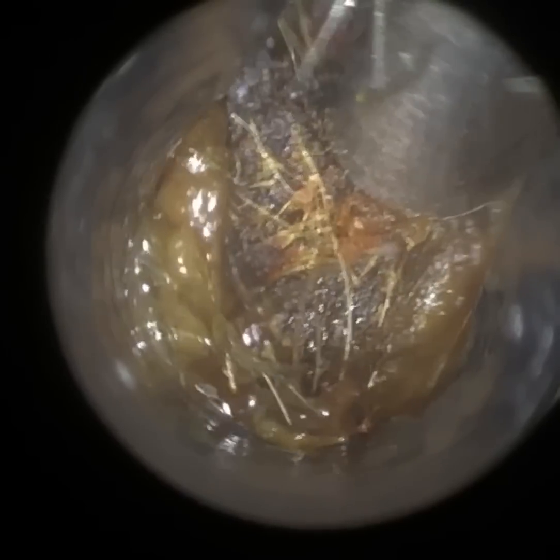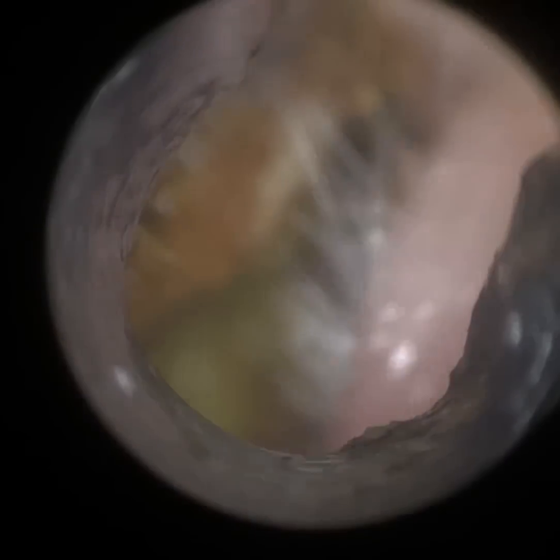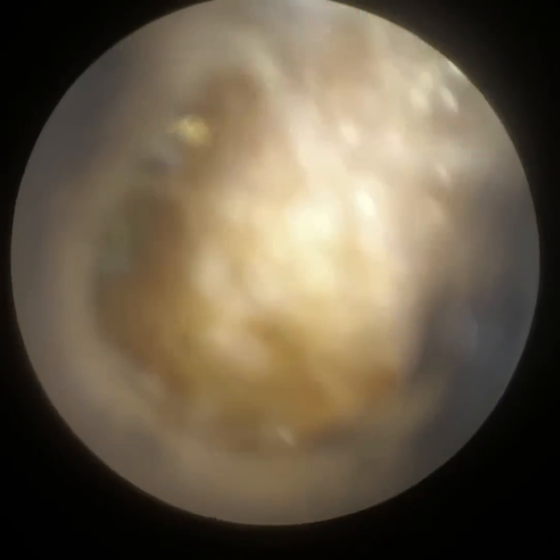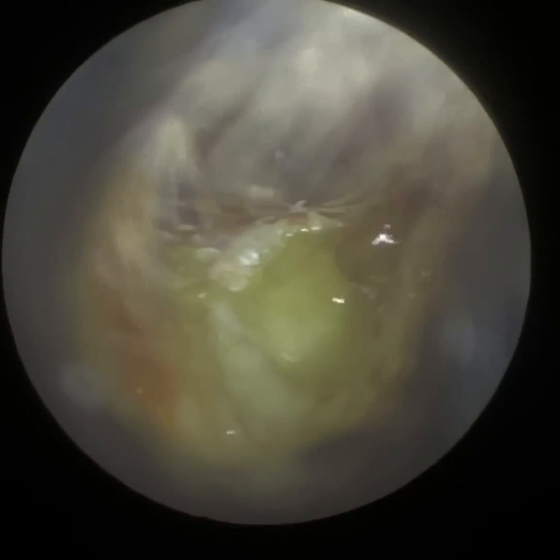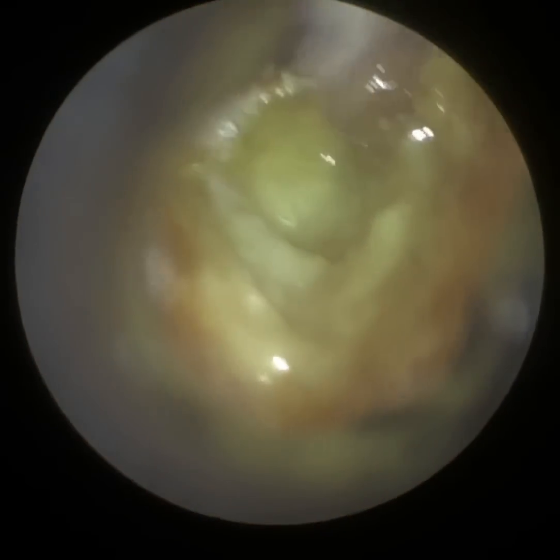As you can see, they've got a really narrow entrance of the ear canal — a bit more narrow than their left. I've got a suction grip and I don't want to let go. A good tip is to just hover over the wax and slowly bring it away. I forgot to take an image of the plugs of white earwax after the procedure — they were extremely large. You can see all this yellow-green discharge here.